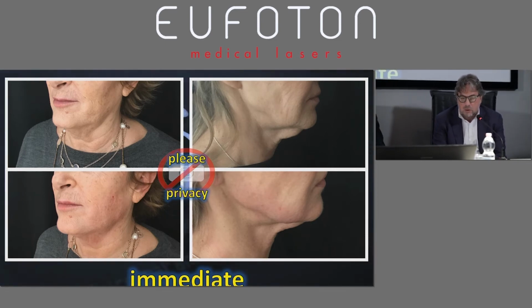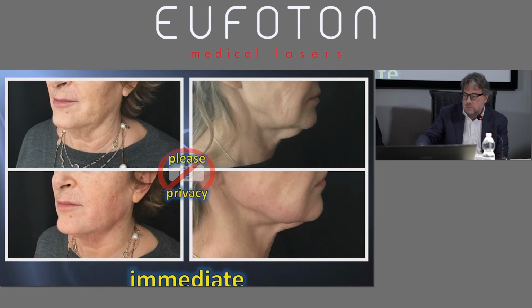For volume remodeling, yes. Usually, I do the laser lipolysis emulsion with ultrasound of the areas where we have more volume. I totally change the setting, and now, at that time, I go and tighten the tissues. When I decide to do these in the same surgical step, that's very important. So the patient, shall we treat once or twice? Should the patient undergo anesthesia once or twice? So I give priority to Endolift with the settings for a good Endolift, and after that I change the setting.